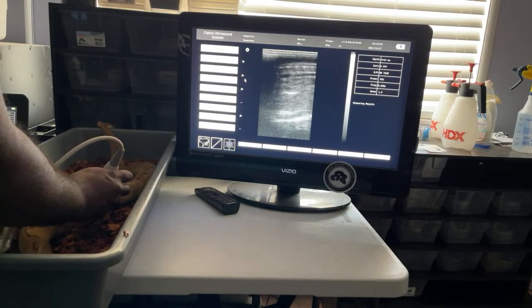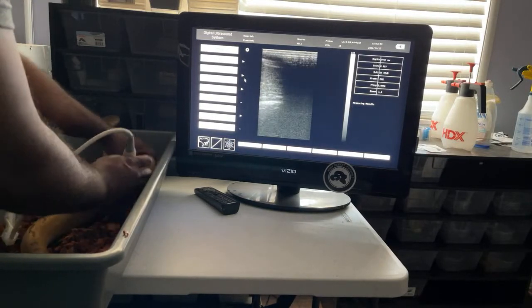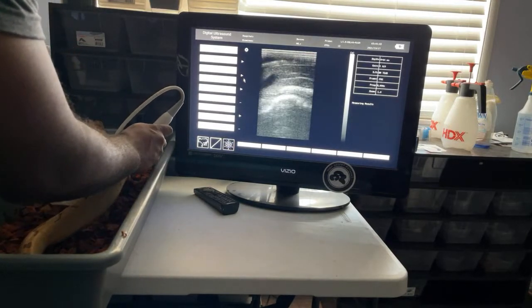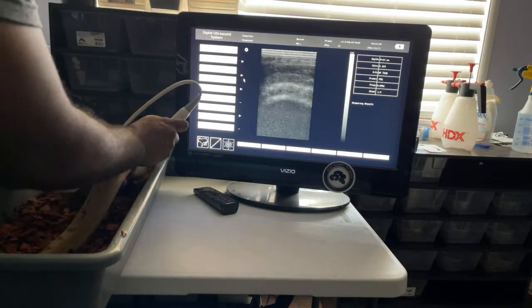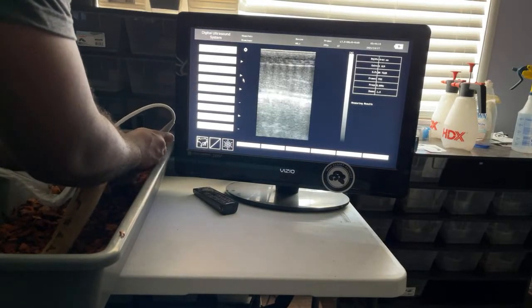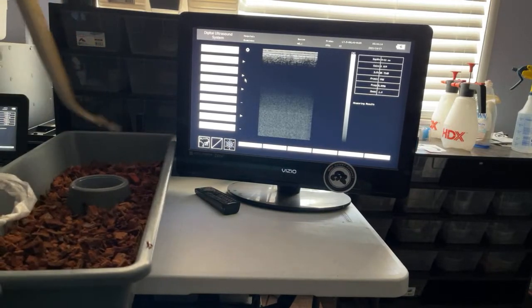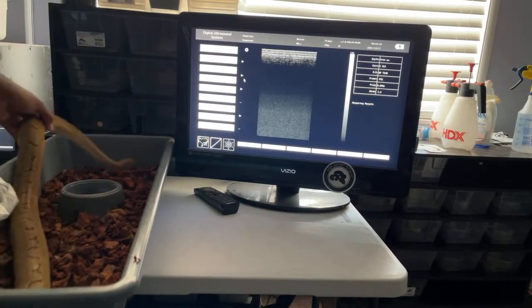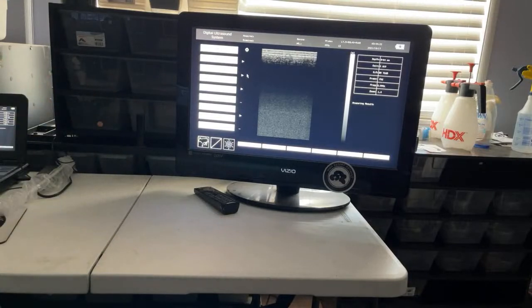Her gallbladder went by. Okay, she did have a couple there. That's a gallbladder. Get ready to hit freeze. Oh, missed it again. All right, she had some small ones up there, some small teeny tinies, so that's a good sign too. I'm not gonna stop and find and freeze that. We'd be all day messing with these damn snakes.